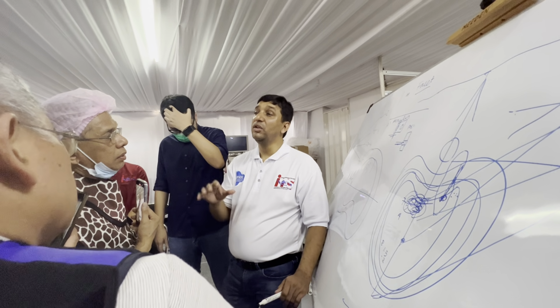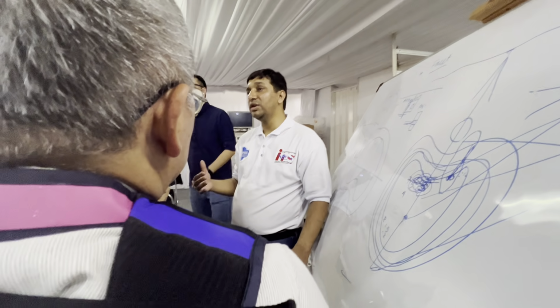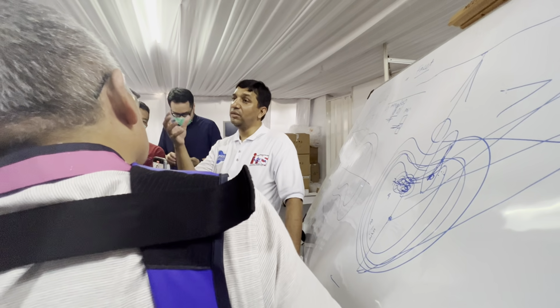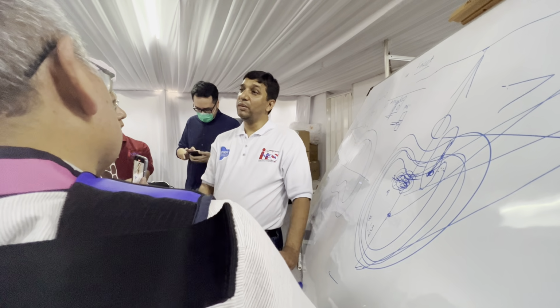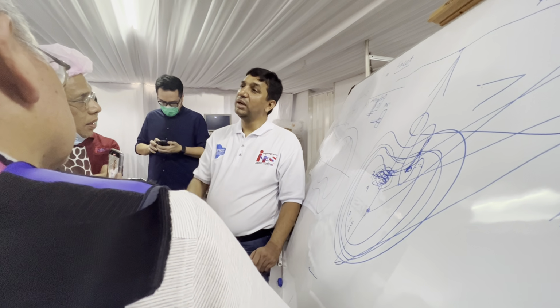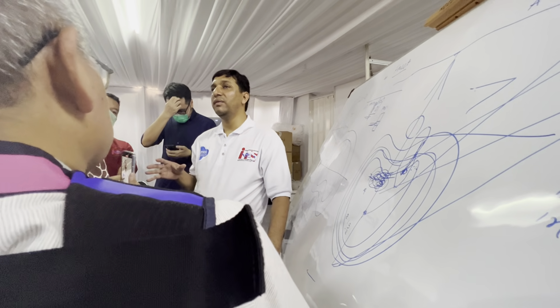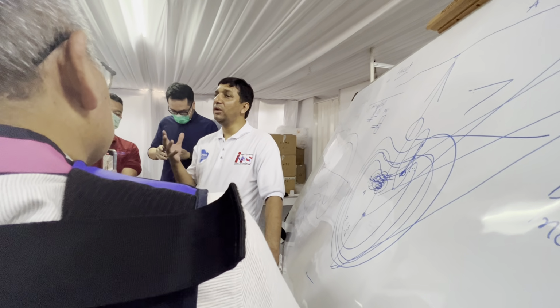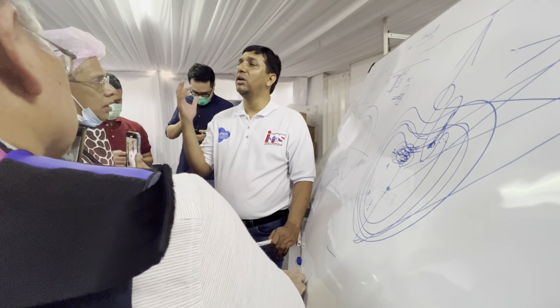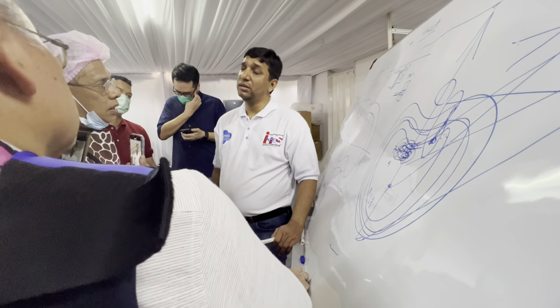And stenosis, especially tight stenosis, the central and lateral canal and foraminal stenosis, we do with the interlaminar technique. Currently we are working on decompressing the foramen and the lateral canal also by the transforaminal route. There we drill the facet and remove the ligamentum flavum from that area. The advantage is that it's very safe. Otherwise, if you don't have good control, there are complications like dural tear, nerve injury or bleeding, so it is a big learning curve.